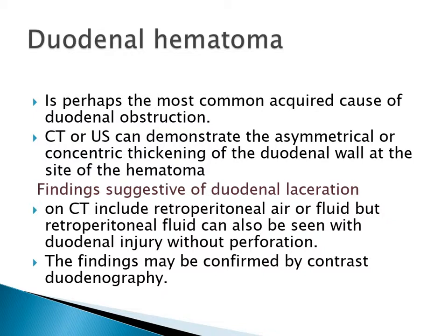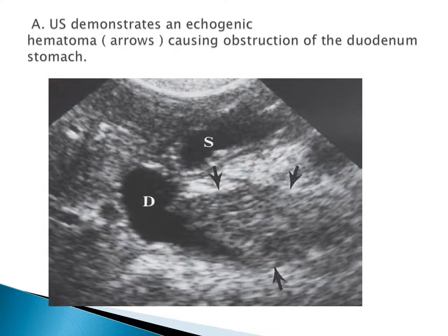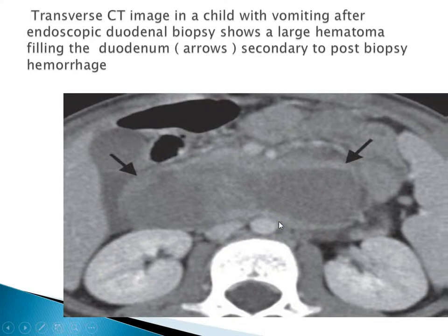Duodenal hematoma is perhaps the most common acquired cause of duodenal obstruction. CT or ultrasound can demonstrate asymmetrical or concentric thickening of the duodenal wall at the site of the hematoma. Findings suggesting duodenal laceration on CT include retroperitoneal air or fluid, though retroperitoneal fluid can also be seen with duodenal injury without perforation. This CT scan shows a large hematoma filling the duodenum secondary to post-biopsy hemorrhage following endoscopic duodenal biopsy.